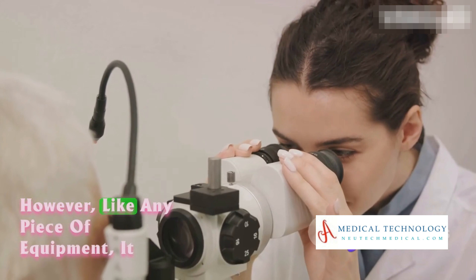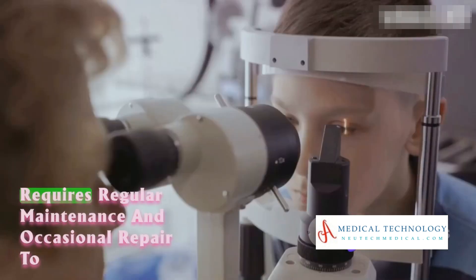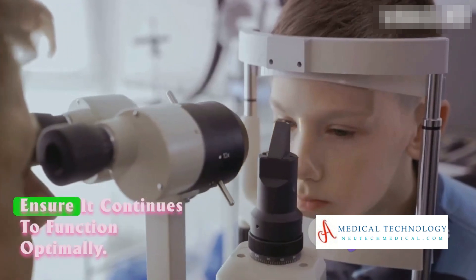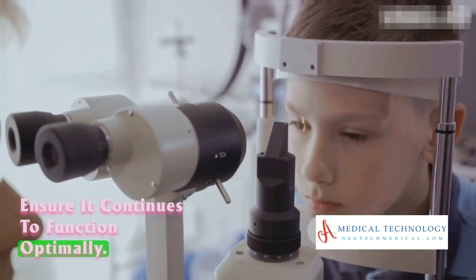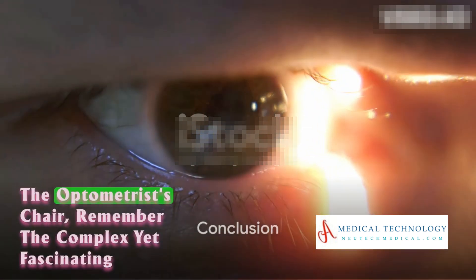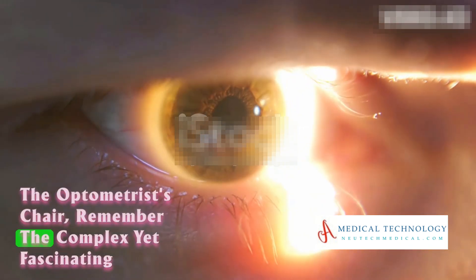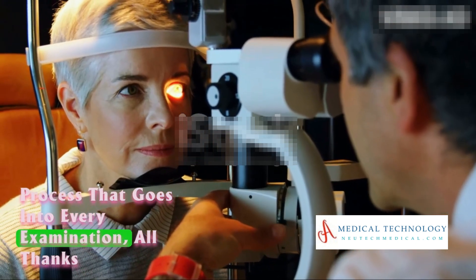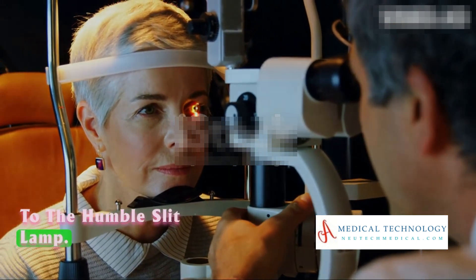However, like any piece of equipment, it requires regular maintenance and occasional repair to ensure it continues to function optimally. So, the next time you find yourself in the optometrist's chair, remember the complex yet fascinating process that goes into every examination, all thanks to the humble slit lamp.